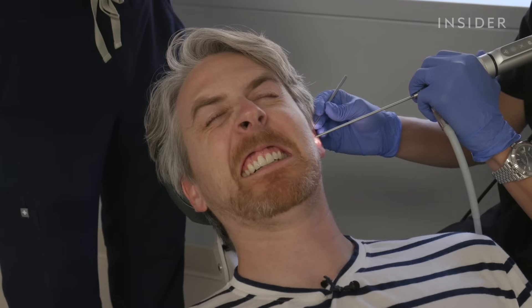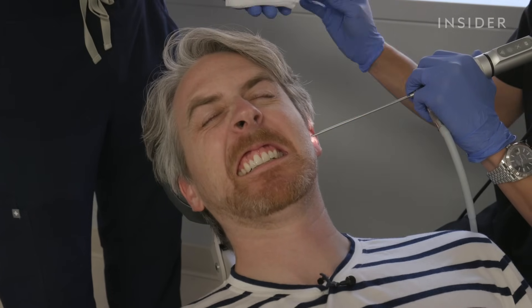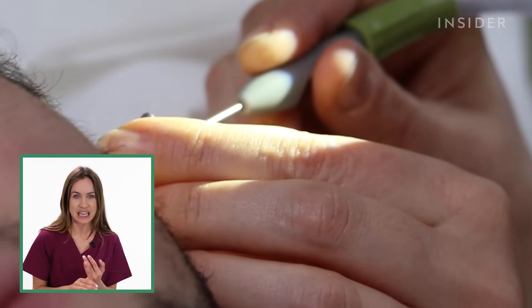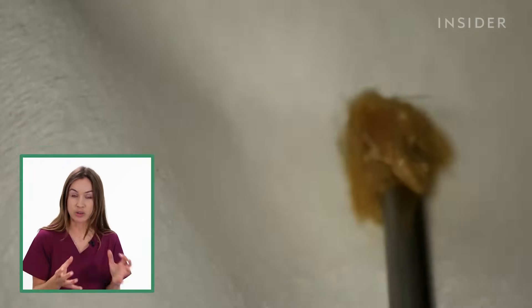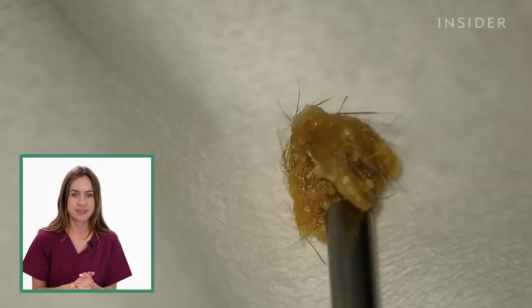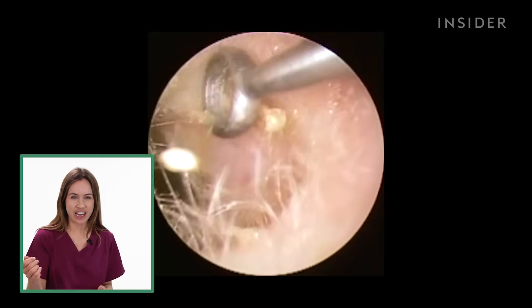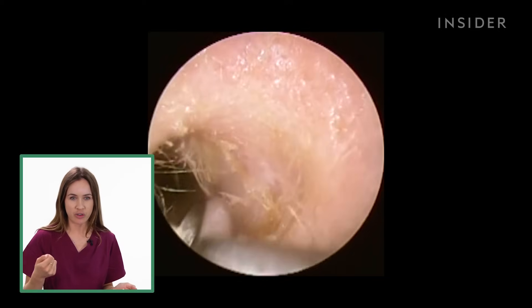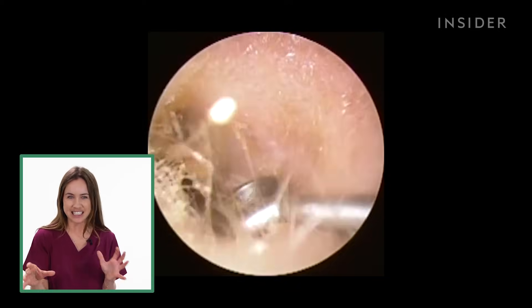This one is so gooey! So the tool used to remove the earwax depends on where in the ear the earwax is, how hard or soft it is, and how big it is. Here you have a hooked-shape instrument, and that can be used to scrape the earwax off the ear canal, a bit like sticky toffee or fudge.